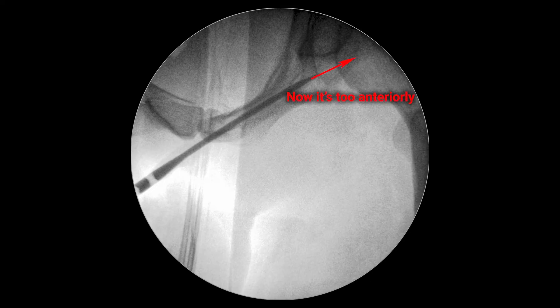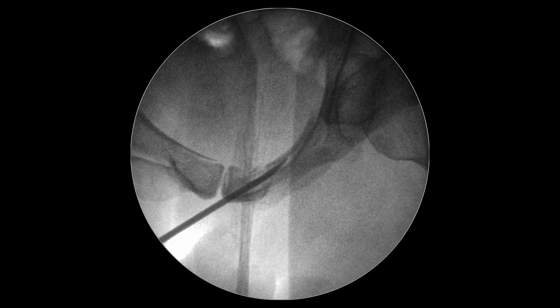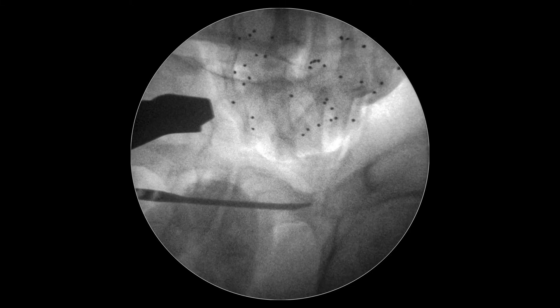Now the nail is going too far anteriorly and will soon come out of the bone. We take the nail back again, repeat the reduction maneuver using the outlet view, and turn the tip backwards in the inlet view.